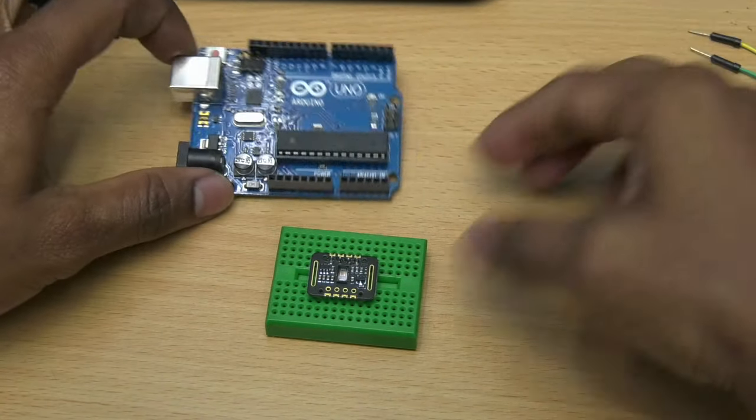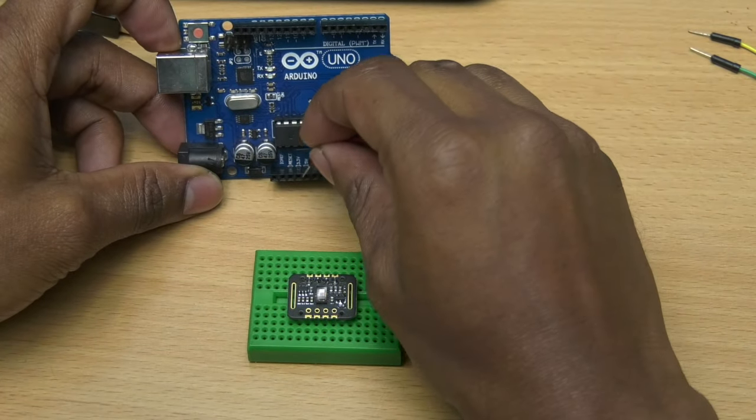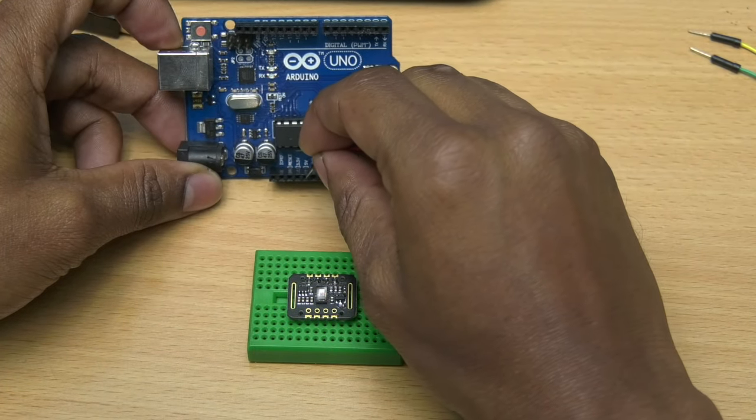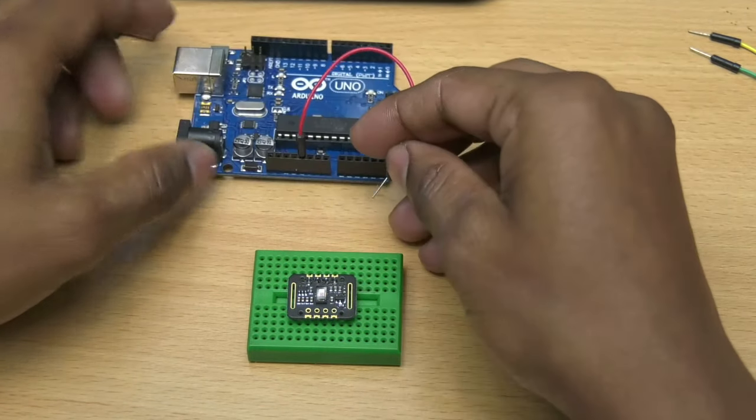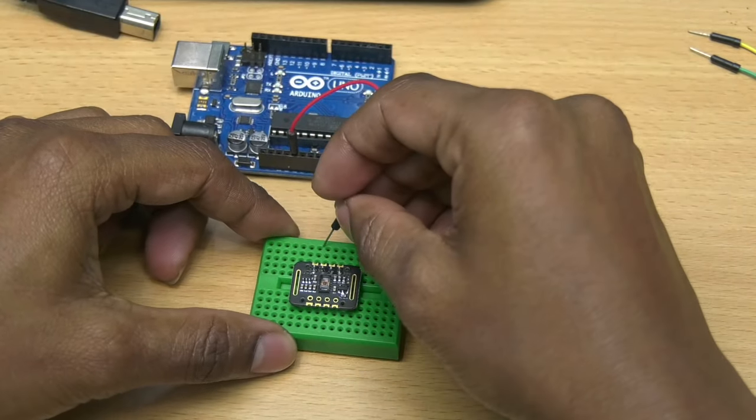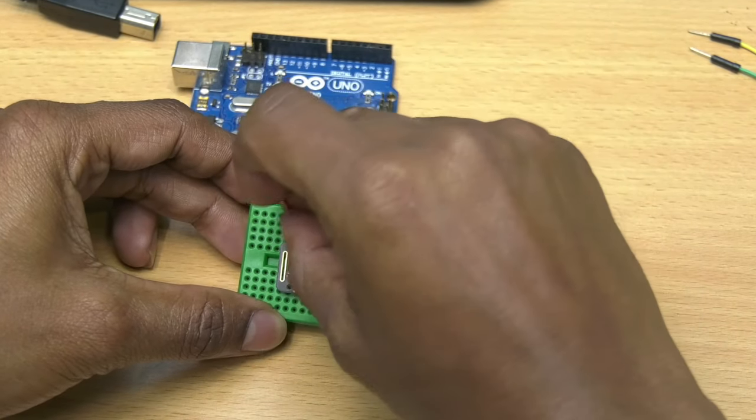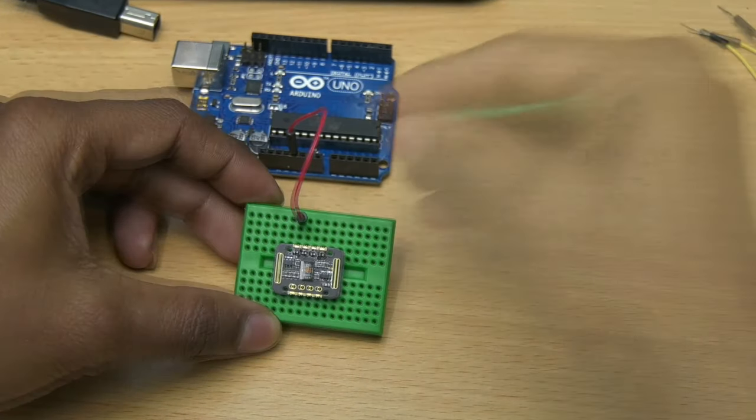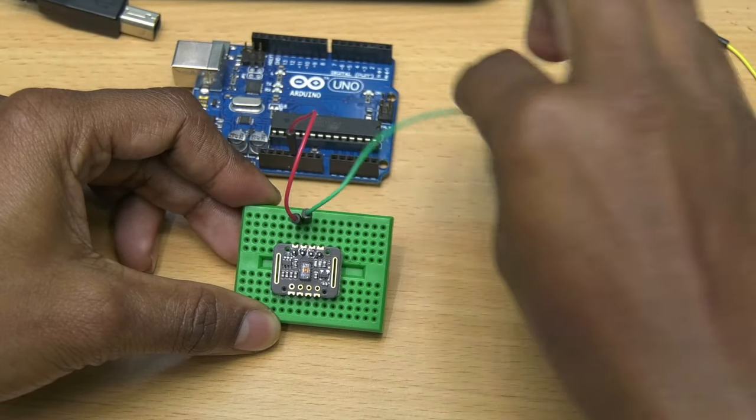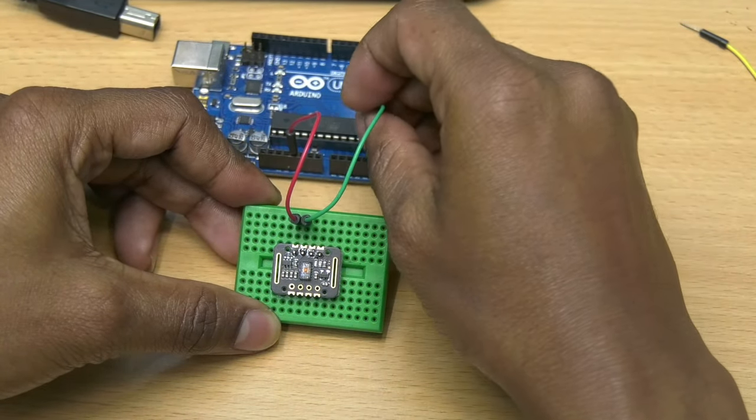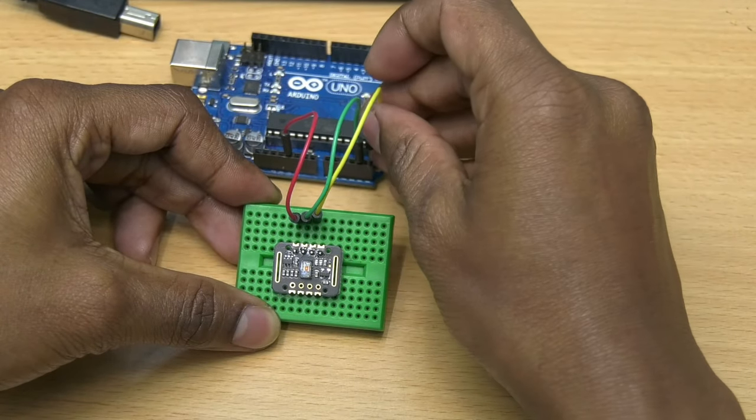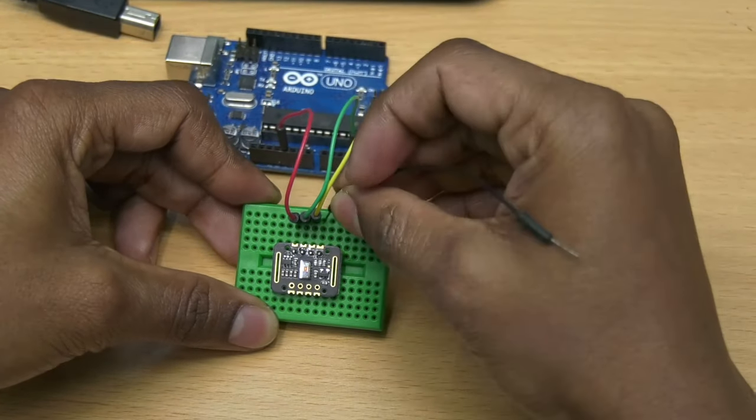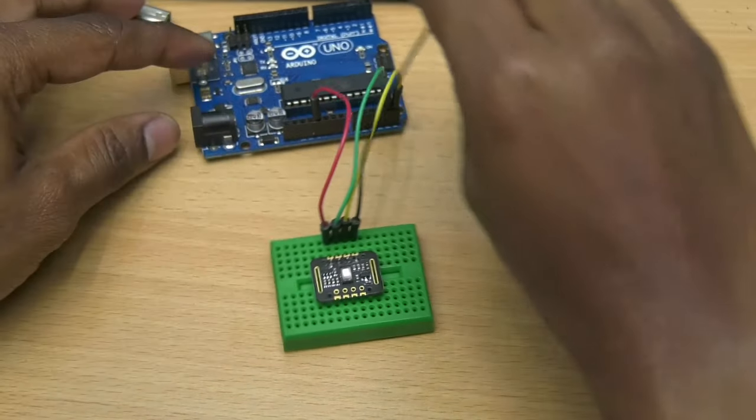Here we are using an Arduino board to communicate with this module. So connect VIN pin of the module to 5V of the Arduino board. Connect SDA to SDA pin, SCL to SCL pin, and then ground to ground of the Arduino board.